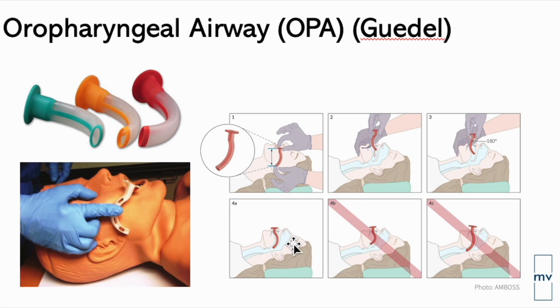That's just so it sits on the patient's tongue. The tip is to slip just below the patient's lips, and the device lands and rests on the patient's teeth. Okay. We don't want to push down very hard. That can cause bleeding.